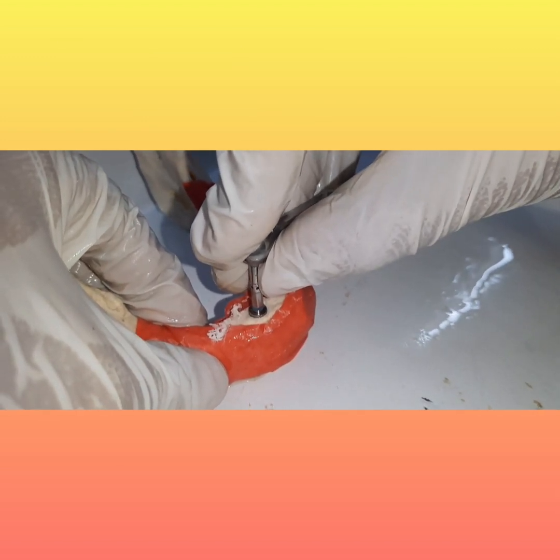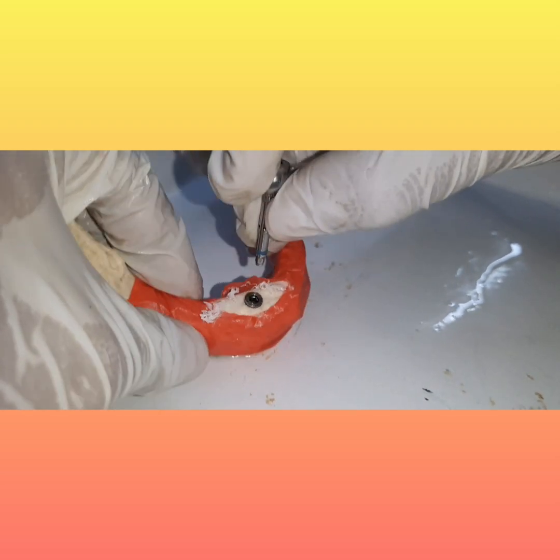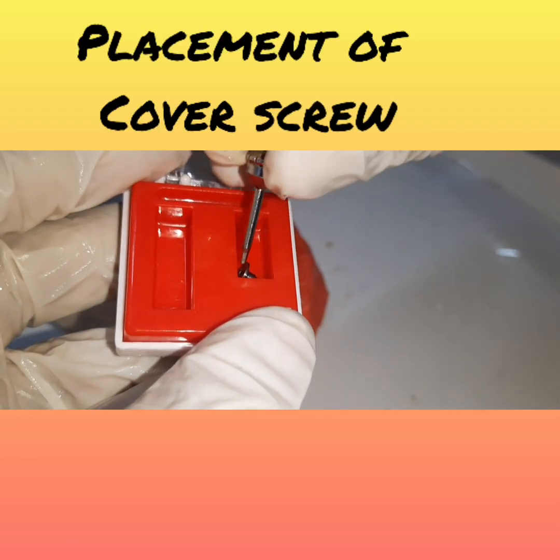Now what we are going to do next is, we are going to remove this and visualize this. You can appreciate this. After this, we are going to place the cover screw. So this is the cover screw.